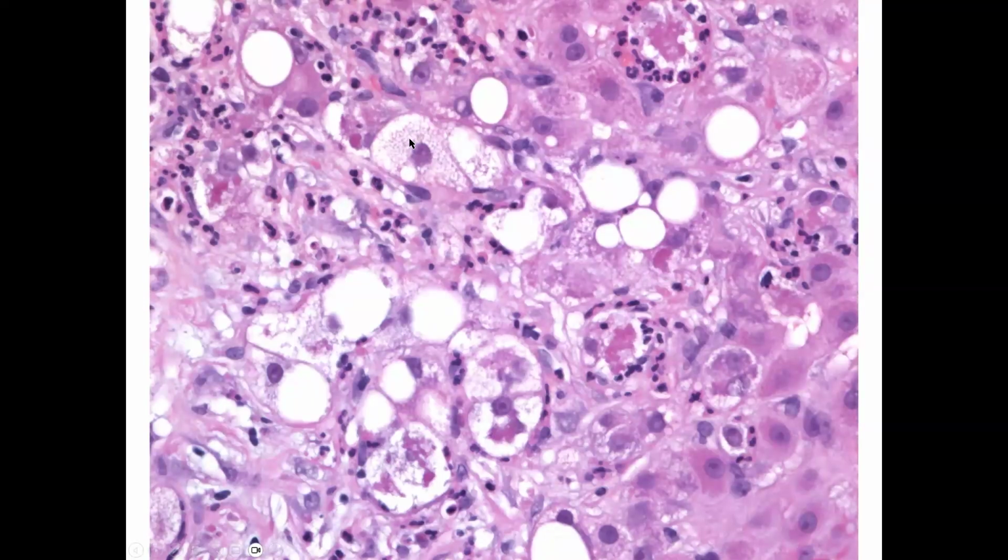So these cells look like balloon hepatocytes from before, but one thing that's really different is they have abundant, very brightly eosinophilic, chunky material in here. So here's just really, really bright red, really, really coarse material within the cytoplasm. So this is Mallory hyaline. And you can see many, many of these cells are surrounded by rings of neutrophils.